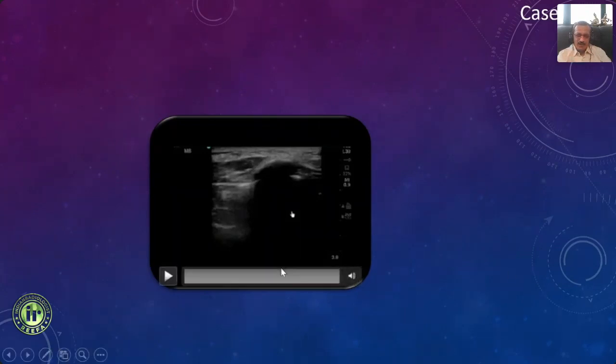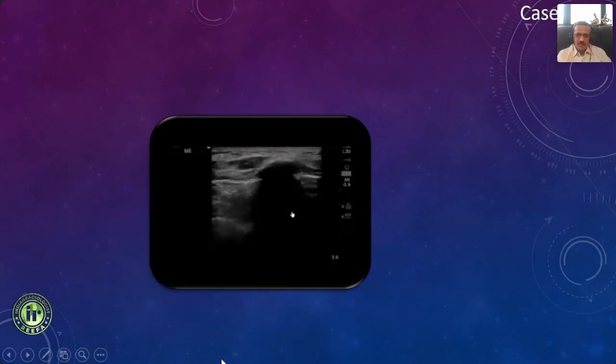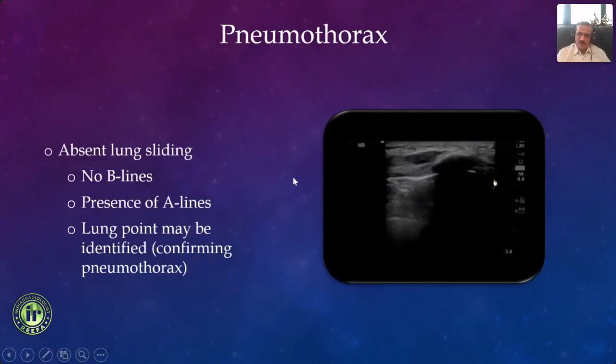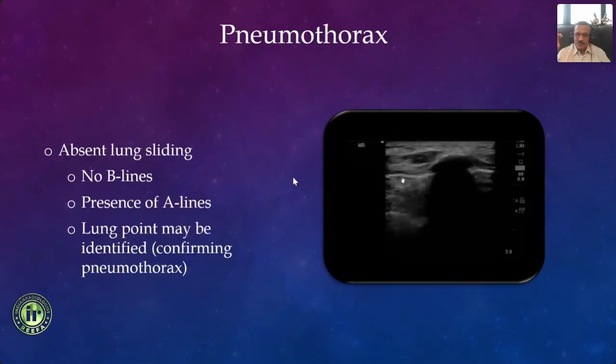You want me to play it again? Yes, play it once more. Atha has got the answer, sir. Fantastic. So what we are seeing here is a very important diagnosis whenever you're doing pleural taps, or like Asif gave me a case of breast biopsy today, where after a deep-seated mass biopsy there was a pneumothorax. So it is very important that we pick it up early on ultrasound.